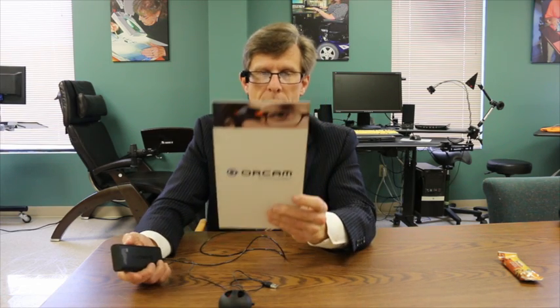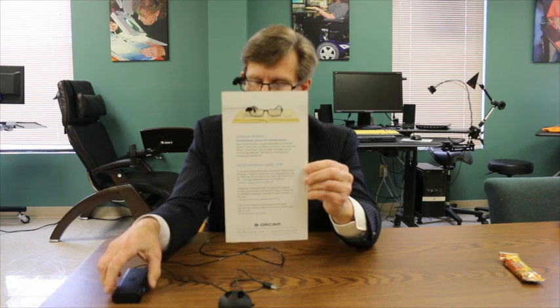Volume up. And now I'm going to take an image of our brochure. [Device reads]: "Individual attention. Complementary one-on-one training session. Each OrCam device is hand-delivered by a certified OrCam trainer who will teach you how to use your..." So this shows that it was reading our brochure.